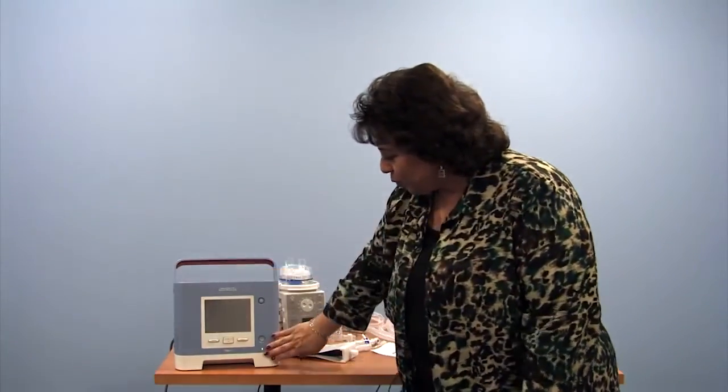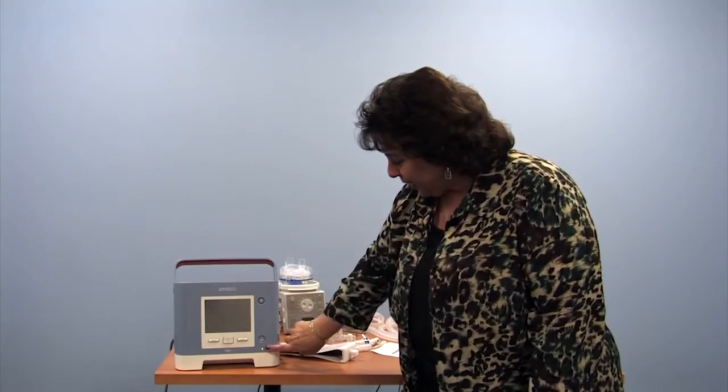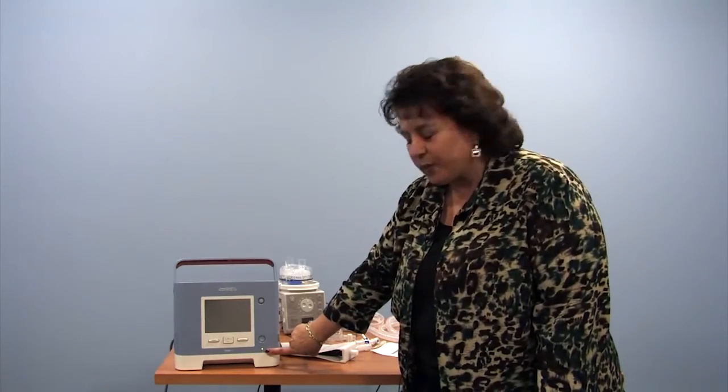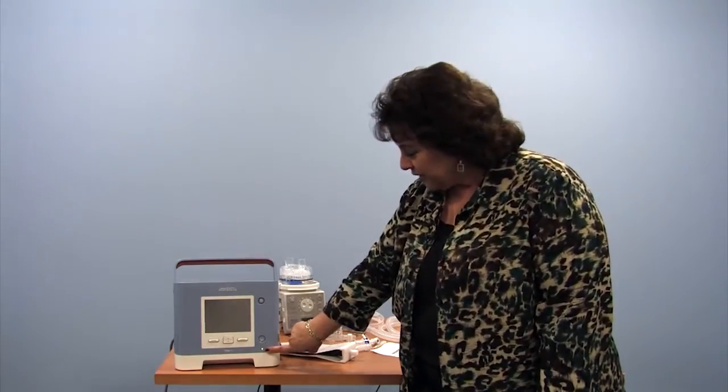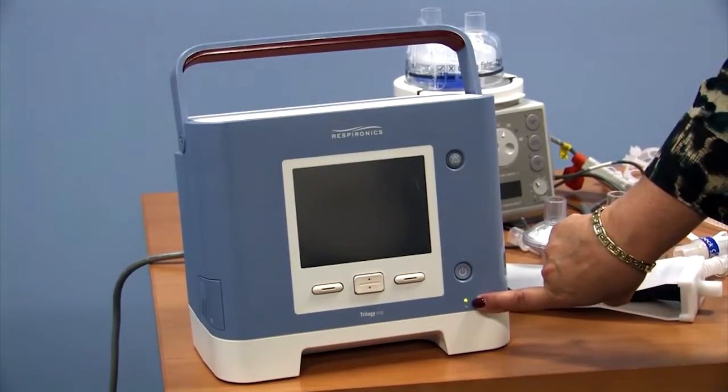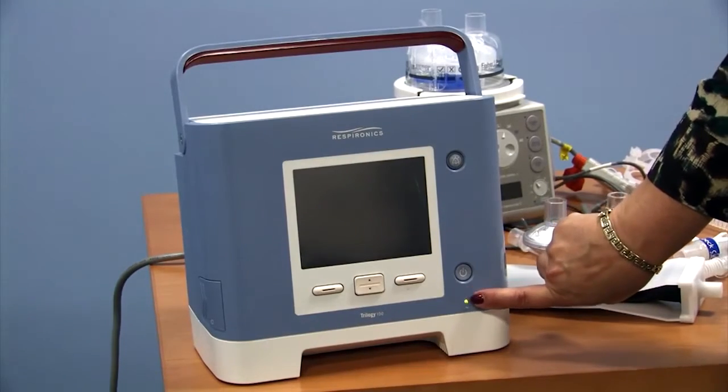This is the Trilogy 100 ventilator. We have a green light here that shows us that the machine is plugged into external power. So important to note that when you glance at the device, you see that you're plugged into wall power. Of course, that would be dependent on a generator, etc., but you know you're plugged into the wall.